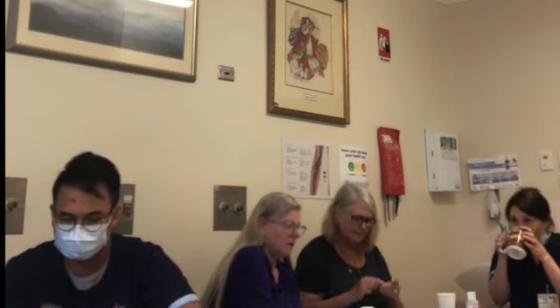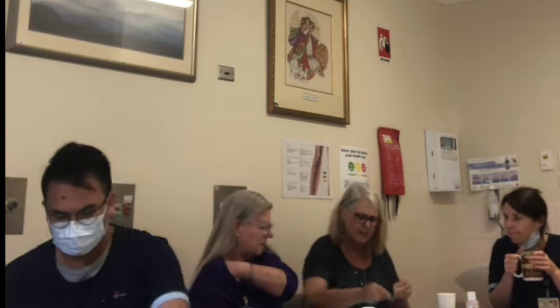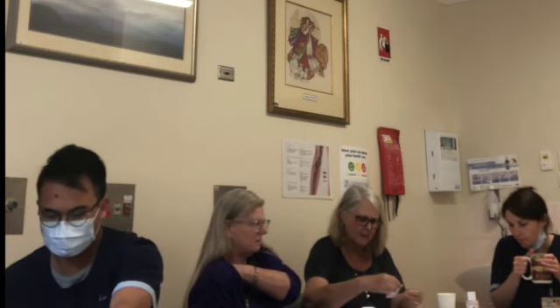Okay. So CT. They've been asking for 20 lately. They get what they get, right? Yeah. So why they're asking for 20 is because have you seen how they give the contrast? It's a massive push infusion. Lots of infusions.